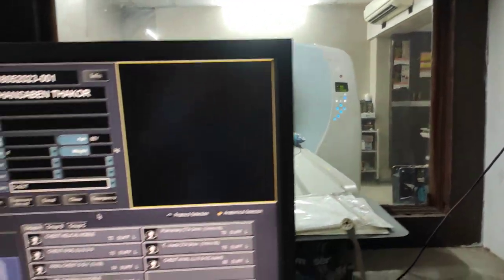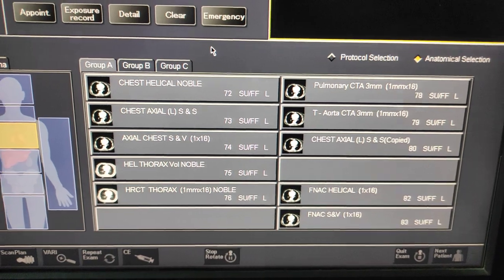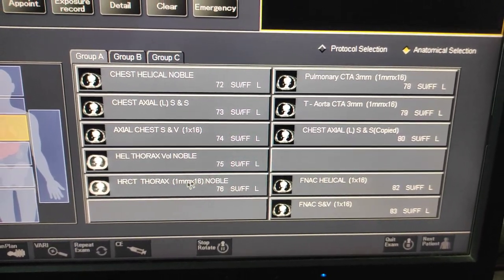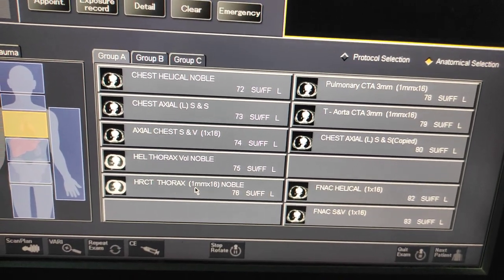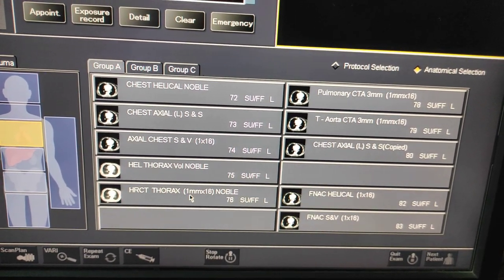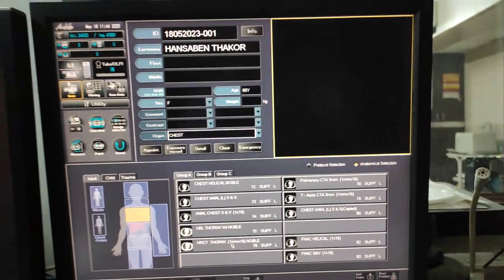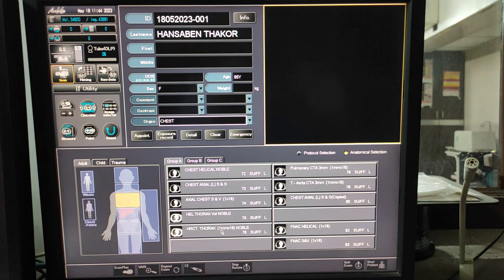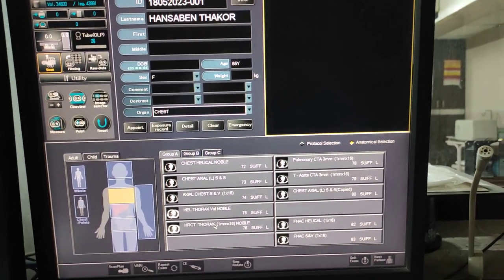Here I have kept the HRCT protocol. Always take an HRCT scan in one millimeter, because it's a high-resolution scan. After scanning, you can reconstruct the images. First of all, we will take a scanogram — click on this protocol.